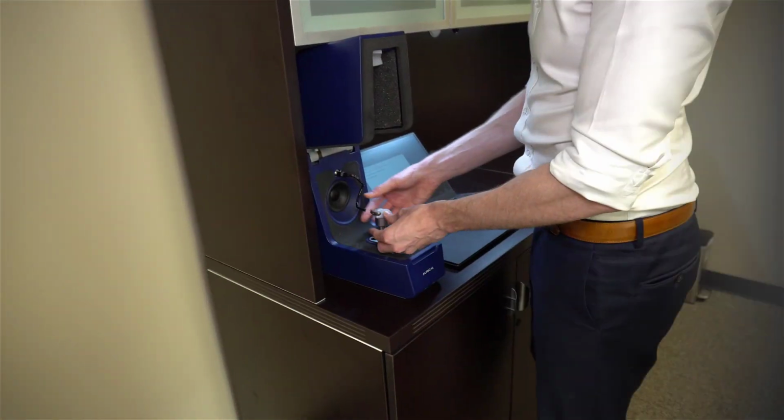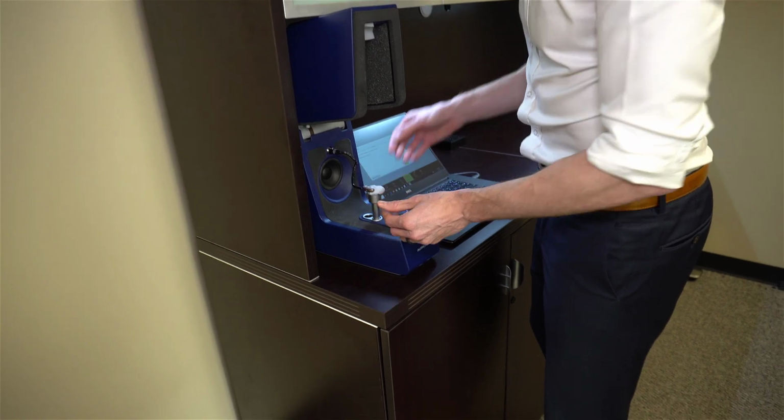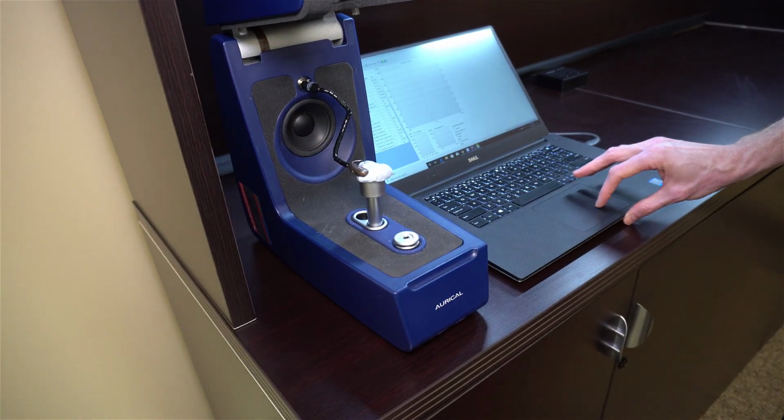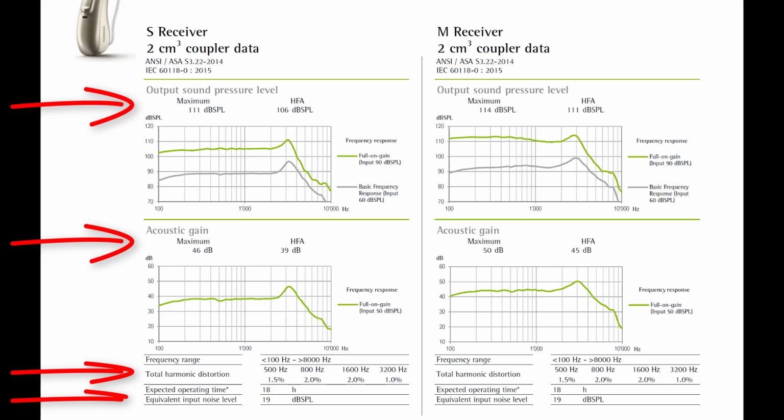So here are the 5 easiest ways for a hearing care provider to cut corners, and the first one is not performing quality control measures on your hearing aids. Quality control is just another way to say testing your hearing aids to ensure that they are mechanically functioning properly. This procedure entails obtaining test box measurement data to ensure that your hearing aids are mechanically performing correctly and meeting manufacturer specifications for things like overall output, gain, distortion, and equivalent input noise.